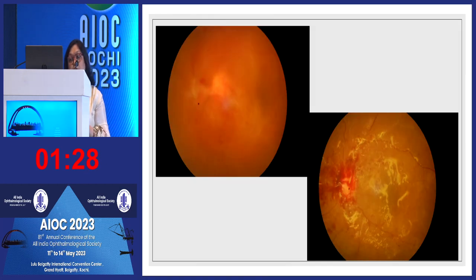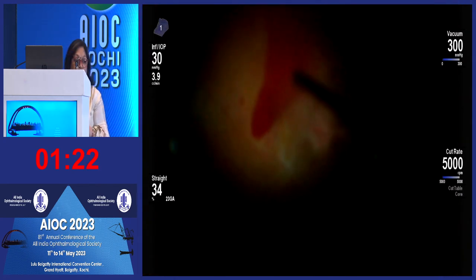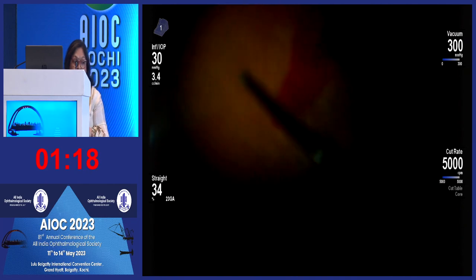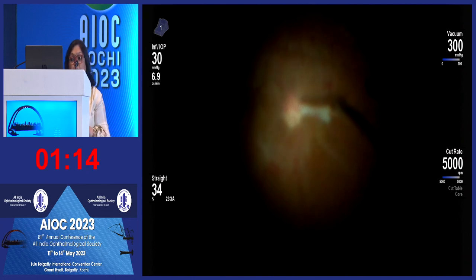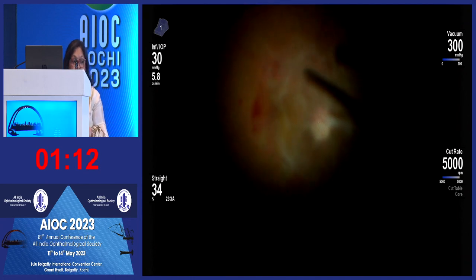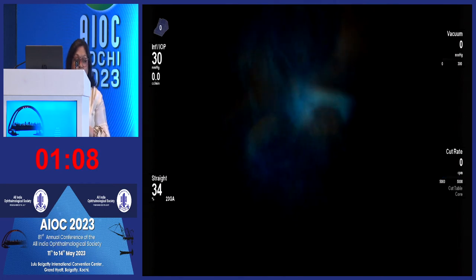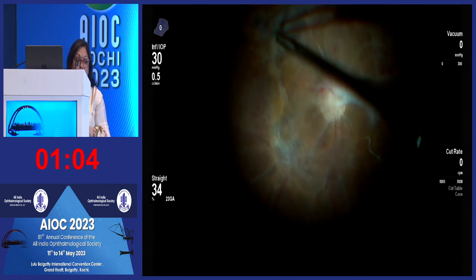This was the post-op of his left eye, and then we went in the same way with his other eye. And you see identical kind of a prolif right at the optic disc. The best is not to peel the prolif completely to the disc, but at the end, once you start peeling from outside inward and you come to the center of the disc, it's important to trim it off at that point instead of trying to pull over the disc and cause more bleeding.